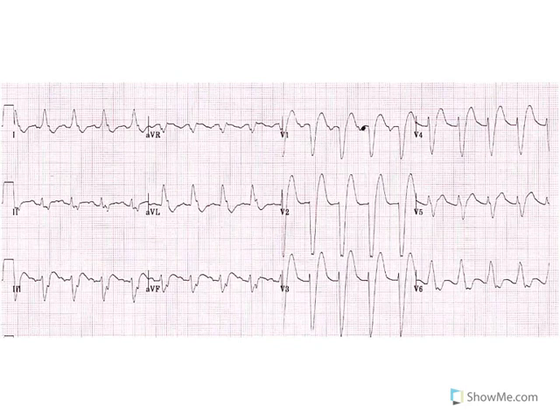It has to go down the right bundle, sort of taking the back roads. It's not going I-90 or anything like that. And then it finally gets to where it needs to be, and then it can repolarize, okay? So it's all in V1 going away from lead V1, all right?